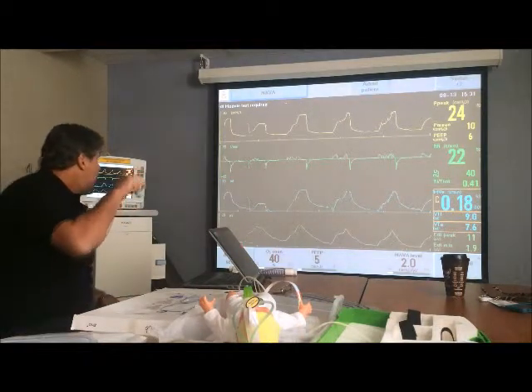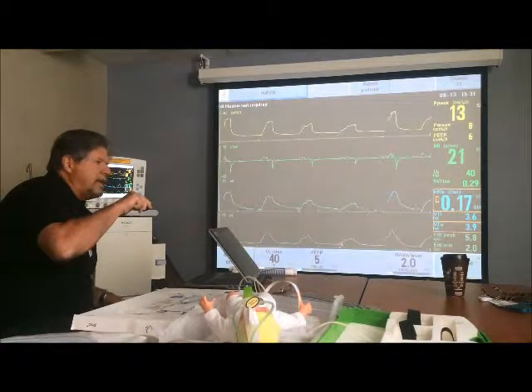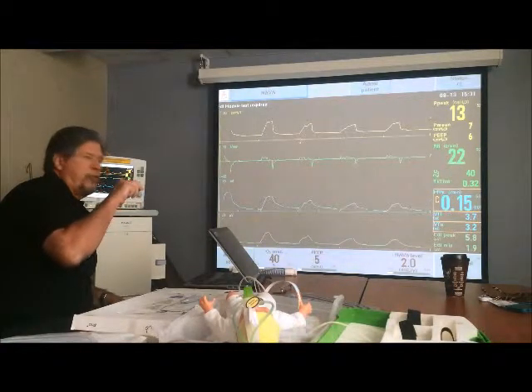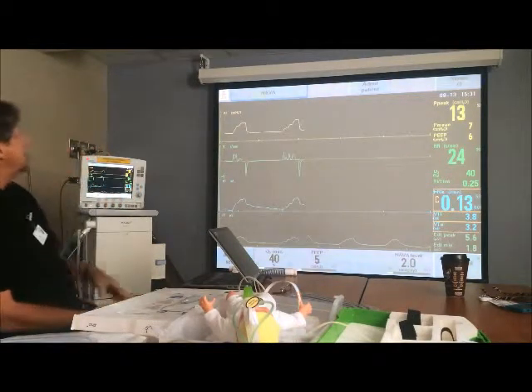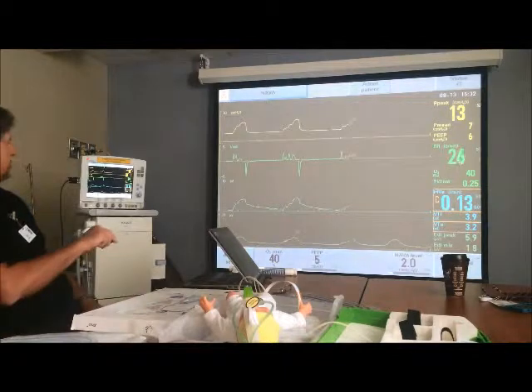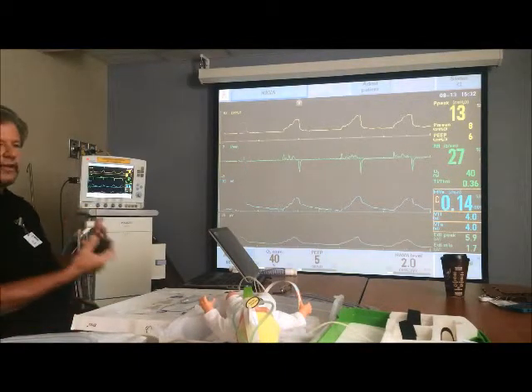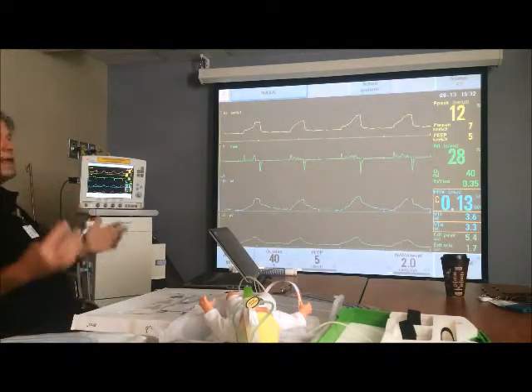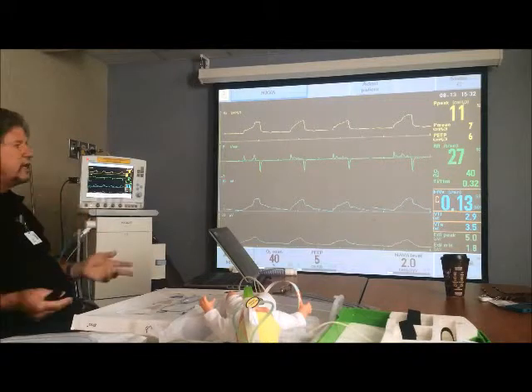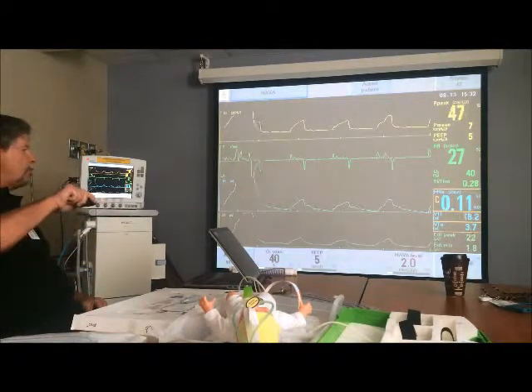So when we're picking up the NAVA, the little pink will be on the EDI rather than being pink on the flow or the pressure wave, like it would be normally in normal ventilation. So this is NAVA. Notice the similarity between the rise in the EDI and the flow, so we have perfect flow synchrony. And so now the baby would be more comfortable, more synchronous.